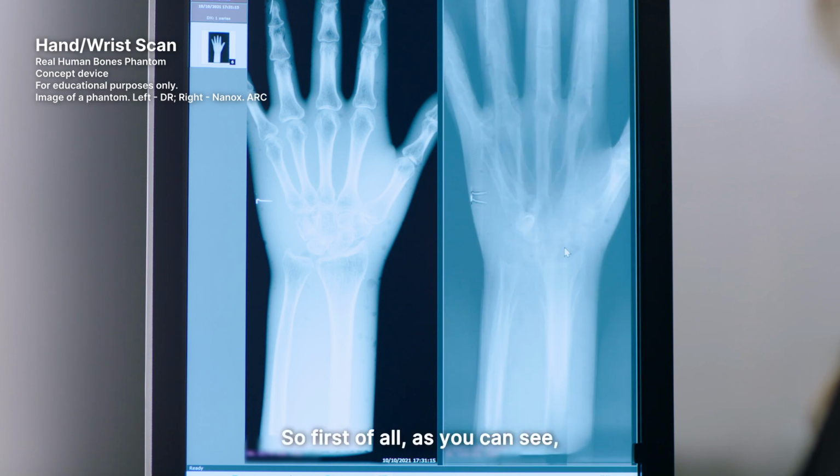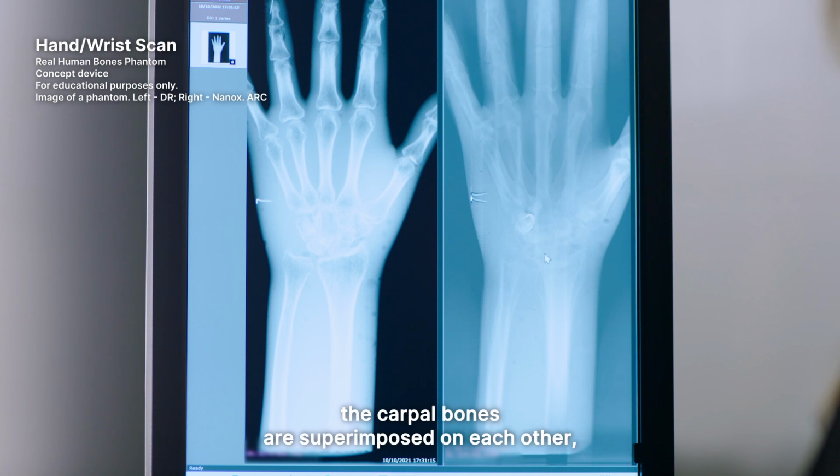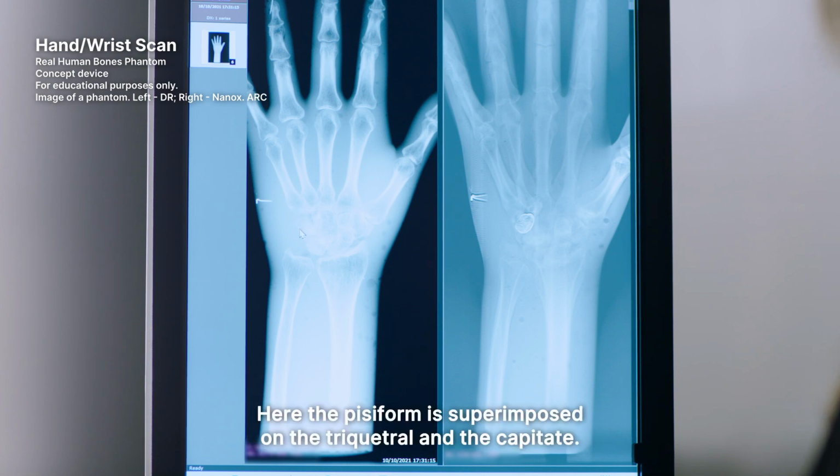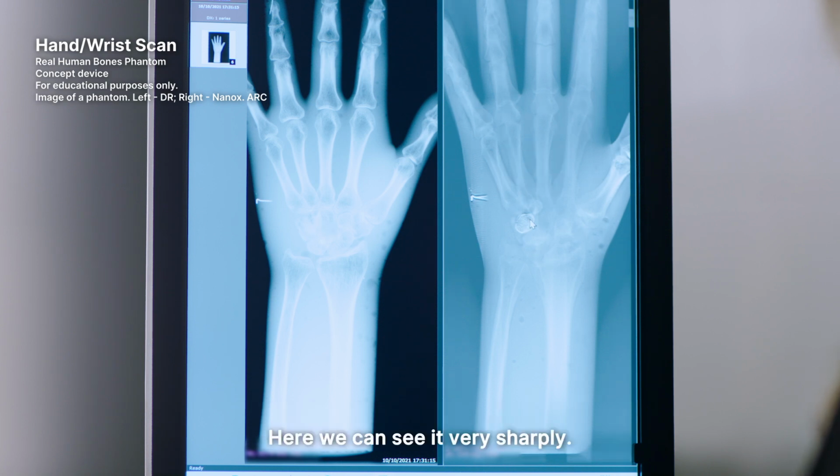So first of all, as you can see, the carpal bones are superimposed on each other. And here at the volar aspect, we can see very nicely the pisiform bone. Here the pisiform is superimposed on the triquetrum and the capitate. Here we can see it very sharply.